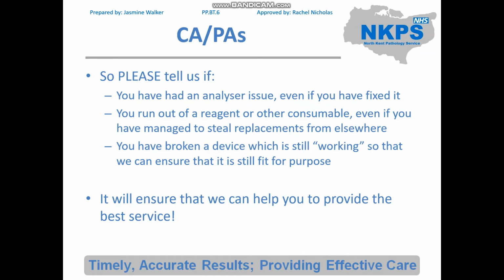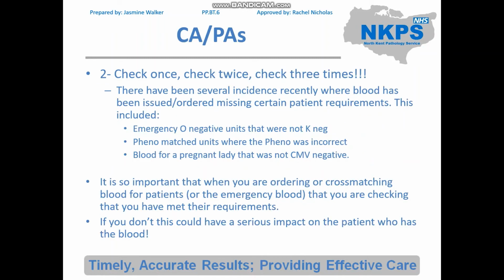So please tell us if you have analyzer issues, even if you fixed it, if you run out of reagents or other consumables, even if you've managed to find replacements from elsewhere, or if you have a broken device which is still working, because it may work at this point, but we don't know what the long-term impact is. It just ensures that we can help you to provide the best possible service for the patients.